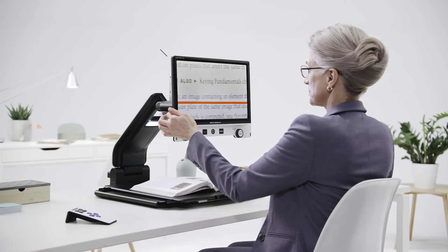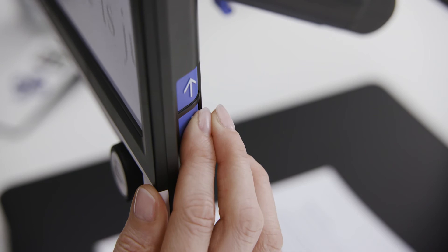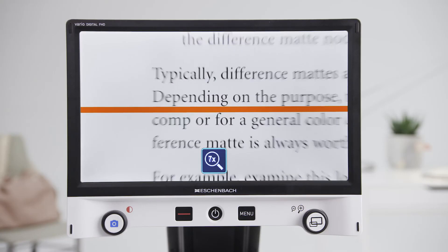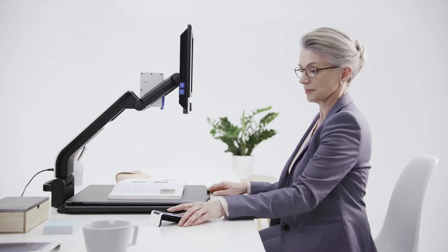In addition, with the dynamic line scrolling feature, you can move the image section horizontally and vertically via the control buttons. Or you can use the remote control, which allows you to control magnification, overview mode and contrast settings.